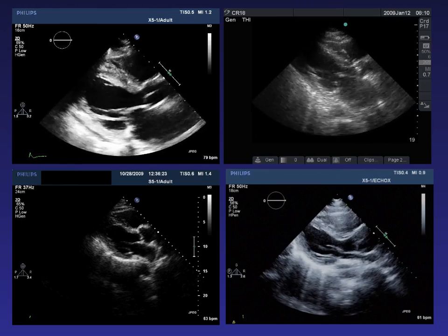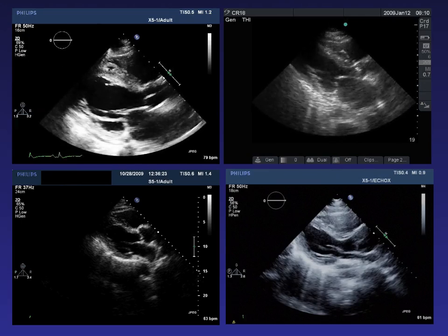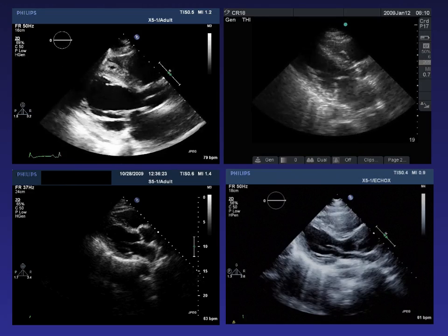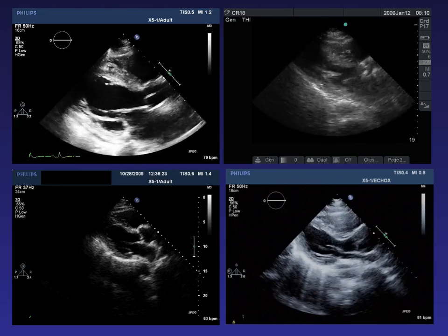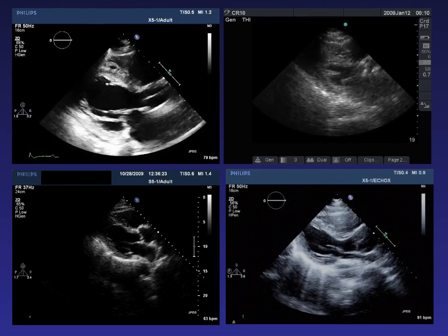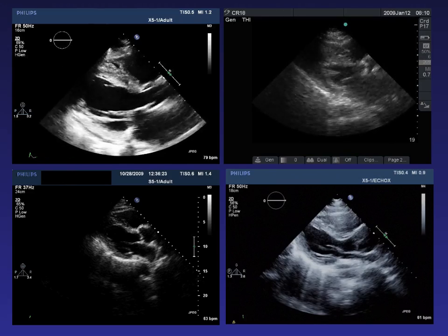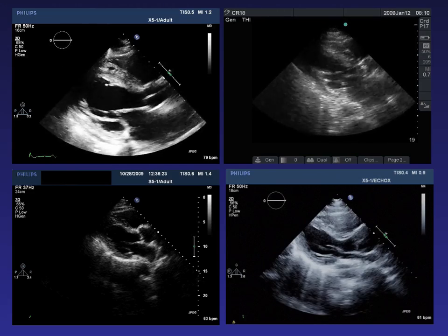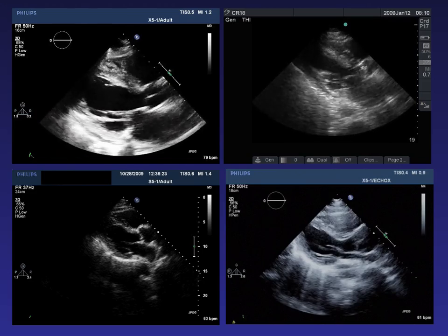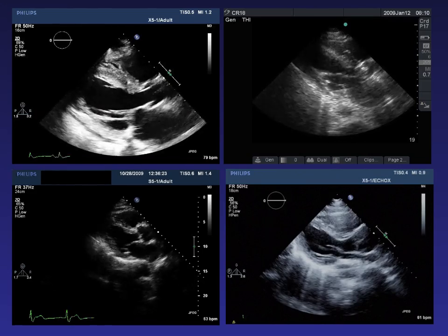This one, the left ventricular function is normal as the anterior leaflet is seen to almost hit the septum a couple times. However, the left atrium is big, and this generates the differential of diastolic dysfunction, atrial fibrillation, significant mitral regurgitation as possible causes. For you advanced readers, I would worry a little bit about the aortic valve, which looks stenotic, which might be causing diastolic dysfunction.